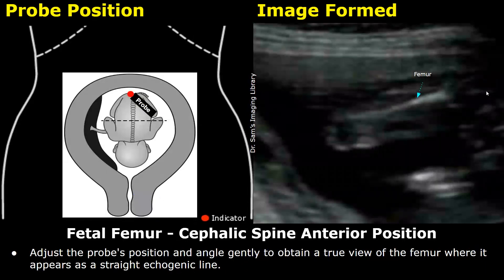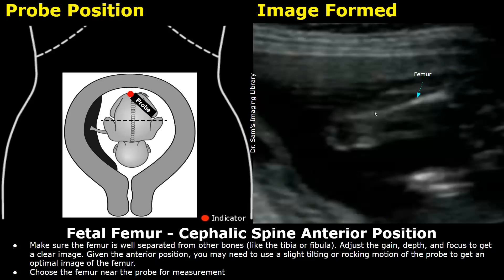You will eventually find the fetal legs. Adjust the probe's position and angle gently to try to obtain a good view of the femur so you can measure the femur length. Make sure to focus on the femur and keep it away from other bones such as the tibia or fibula. Adjust the gain, depth, and focus to get a clear image. You may have to slightly tilt or rock the probe to get a good view of the femur.